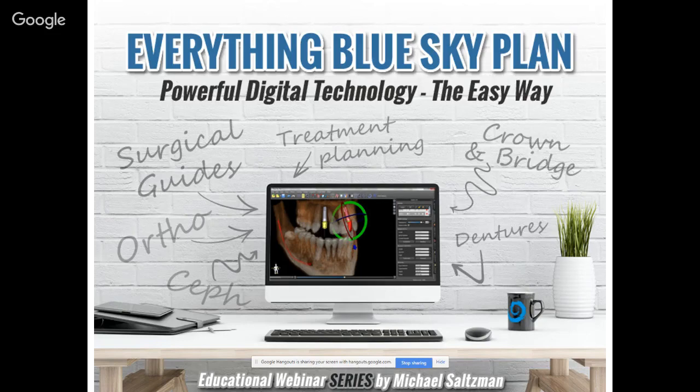The point of this webinar series is to give practical step-by-step instructions on how to use Blue Sky Plan to accomplish those goals directly in your practice — to benefit you, your practice, and your patients. We're focusing on how to use the software: the step-by-step process flows, where to click, what to press. This series is directed at new users getting familiar with Blue Sky Plan, but also at existing users.